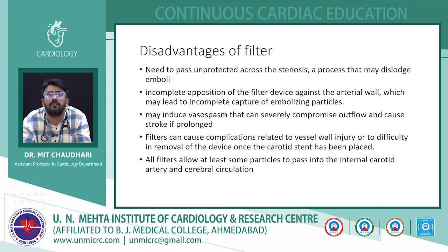So that is one disadvantage. Another is incomplete apposition of the filter, which can lead to embolization of small material into the cerebral circulation. The filter itself can cause vasospasm or damage to the carotid artery, and sometimes retrieval of the filter can also become difficult once the stent has been placed.